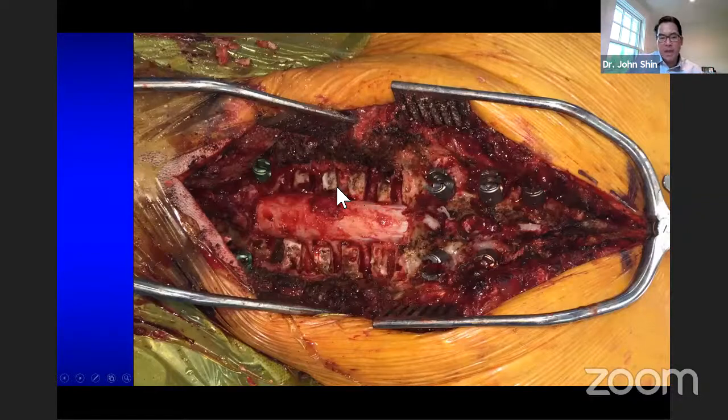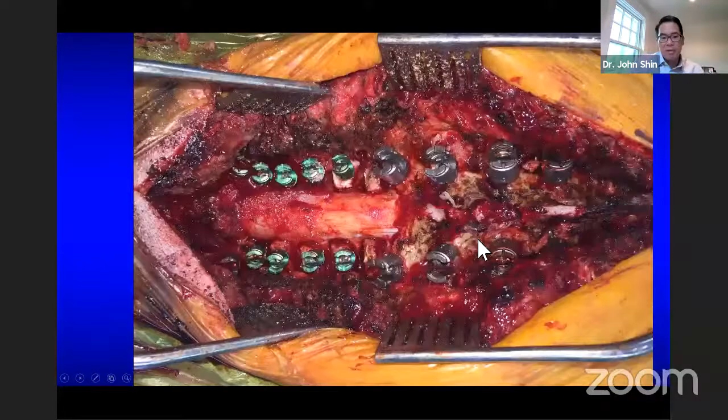So for me, with lateral mass screws, the bailout strategy is going to be cervical pedicle screws, if needed, which really provides excellent fixation, actually much better than lateral mass. And then after that's done, so after this was done, we basically do the osteotomies, then I'll place the screws here.